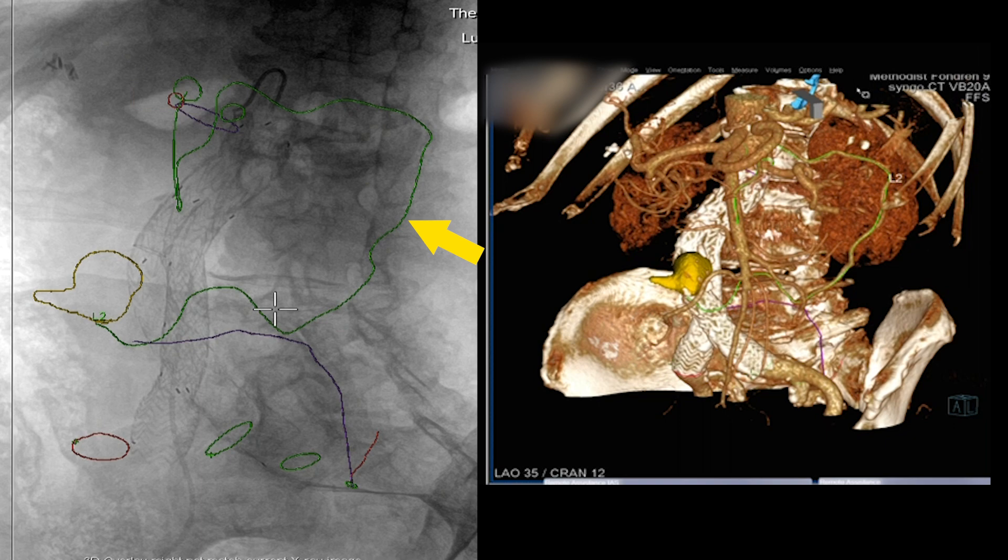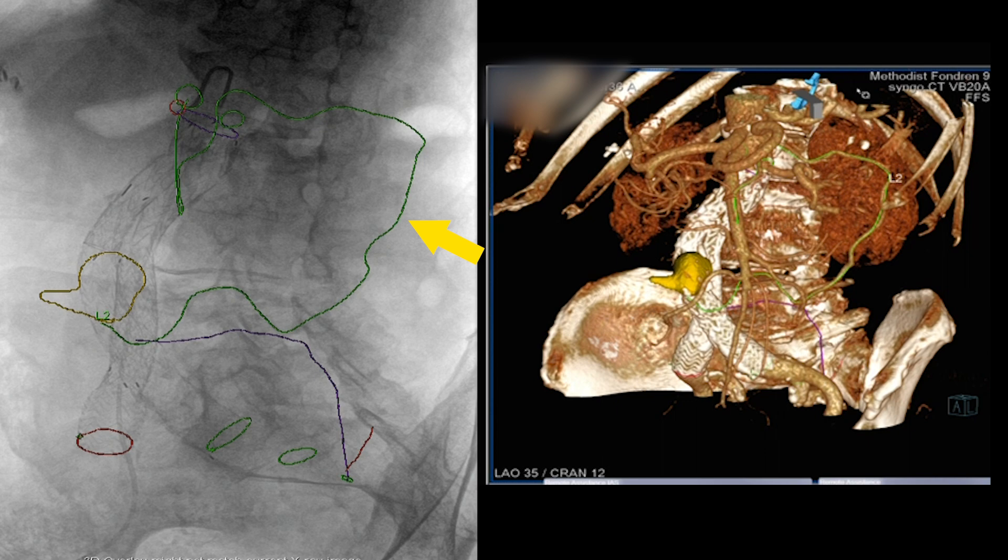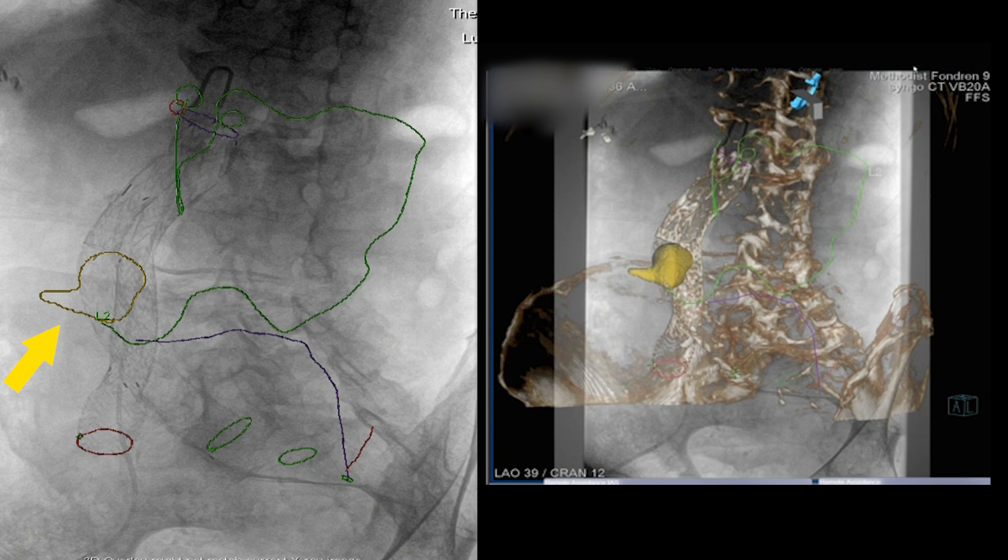In this video, we're going to demonstrate how we use dynamic CT preoperatively to map out the pathway from the SMA through the marginal artery of Drummond to the endoleak cavity. These arrows are showing the endoleak cavity and how we're actually going to try and get there.